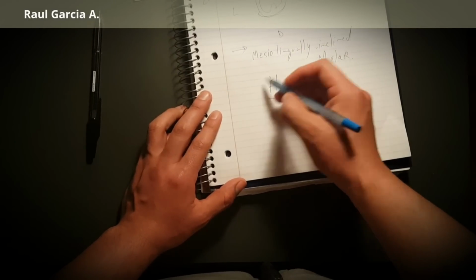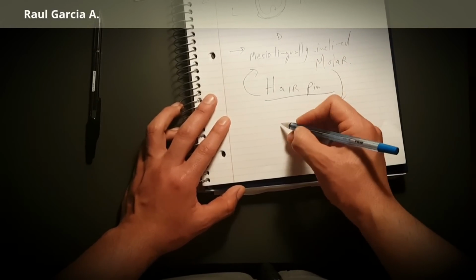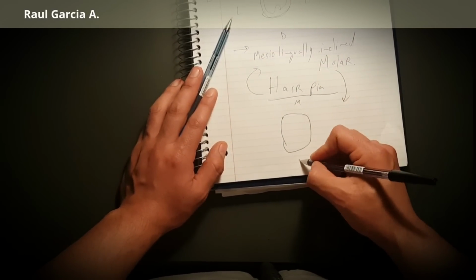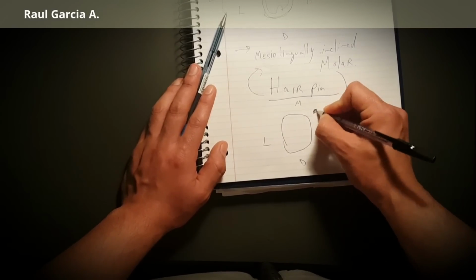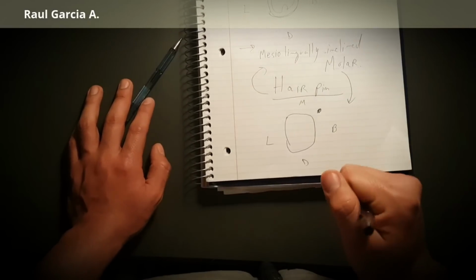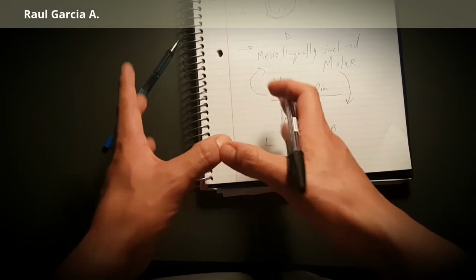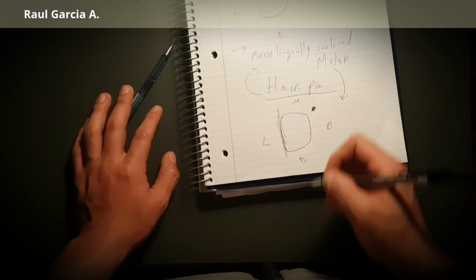When we have a mesially inclined molar, but now we're going to have our undercut, this is mesial, this is distal, this is buccal, this is lingual, in the mesial buccal. So we have a mesial lingual inclined molar, but the undercut here is too much because of the inclination, so we do not have space to enter with our structure there, our path of insertion. So we need to engage a mesial buccal here.